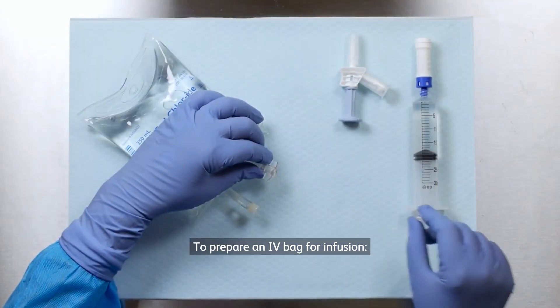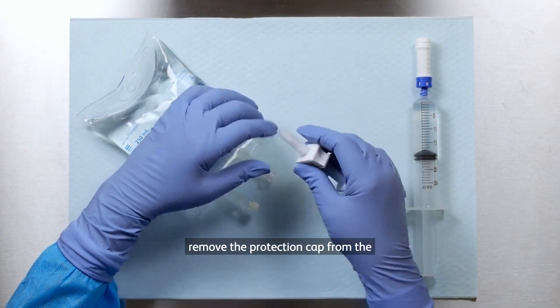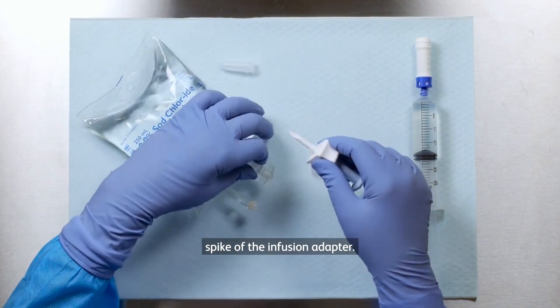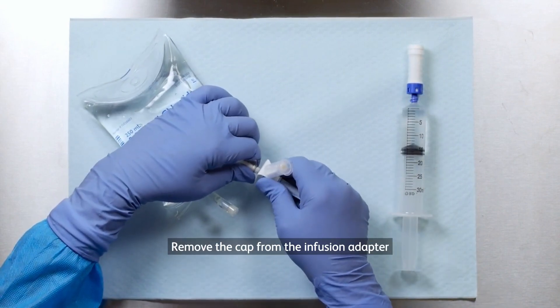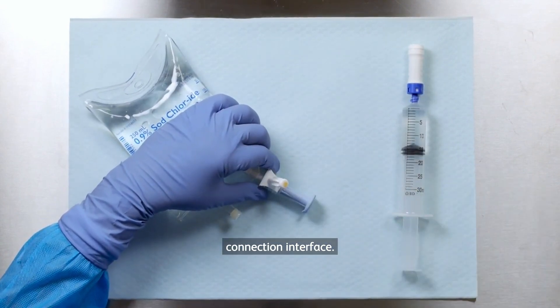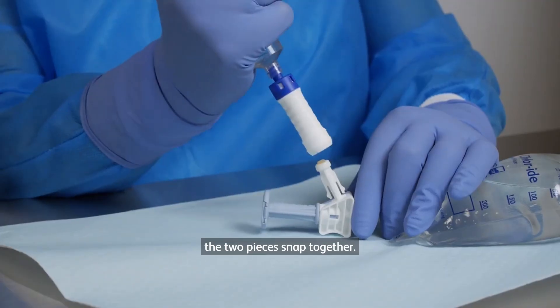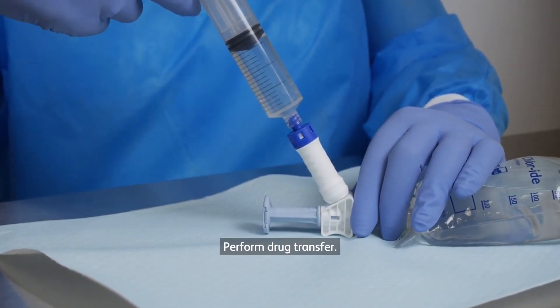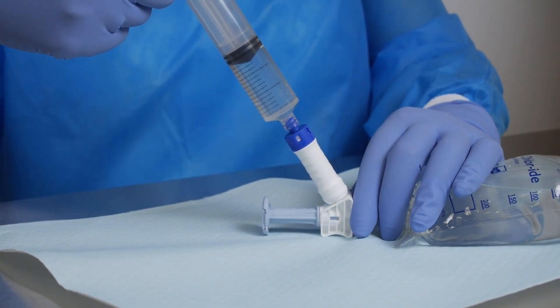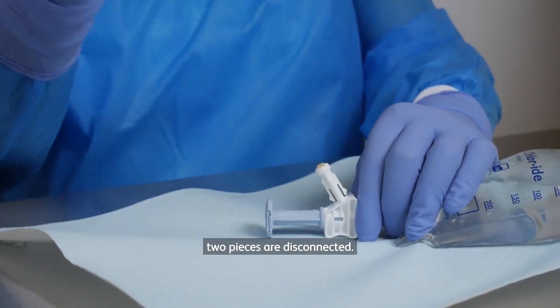To prepare an IV bag for infusion. Slide the injector straight onto the connection interface until the two pieces snap together. Perform drug transfer. Pull the injector straight back until the two pieces are disconnected.